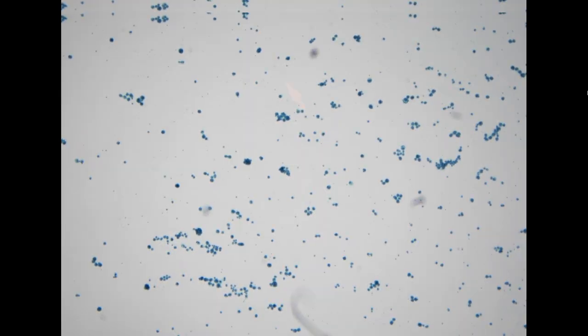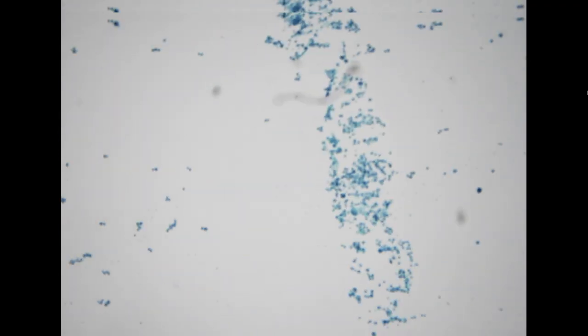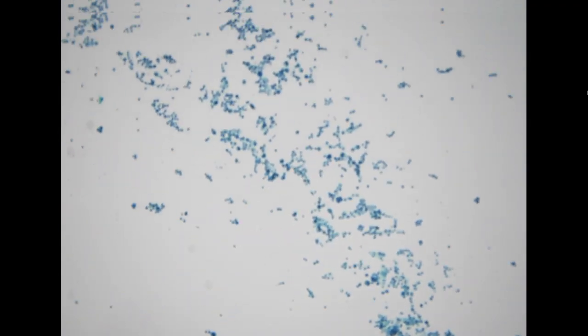So what does a true metastatic adenocarcinoma look like in a pleural effusion specimen? This is a 69-year-old female with a history of lung adenocarcinoma. On low power, the background seems to be very clean, and we have these big cells, some in loosely cohesive clusters, some as individual cells, but these cells are very big.